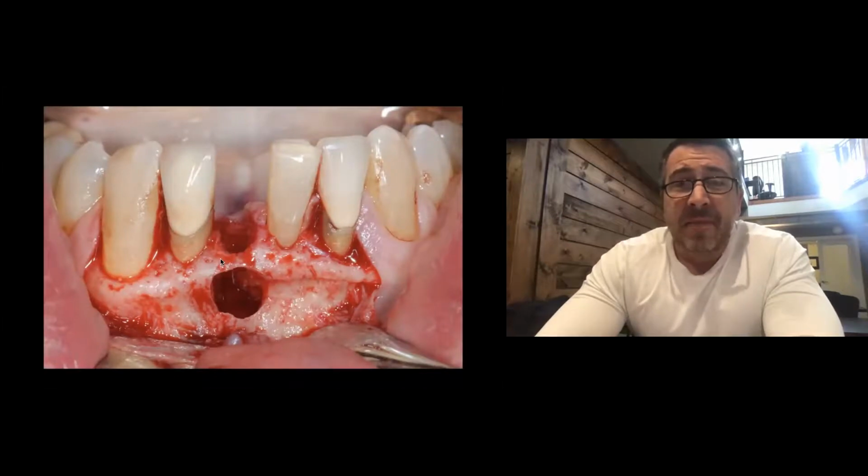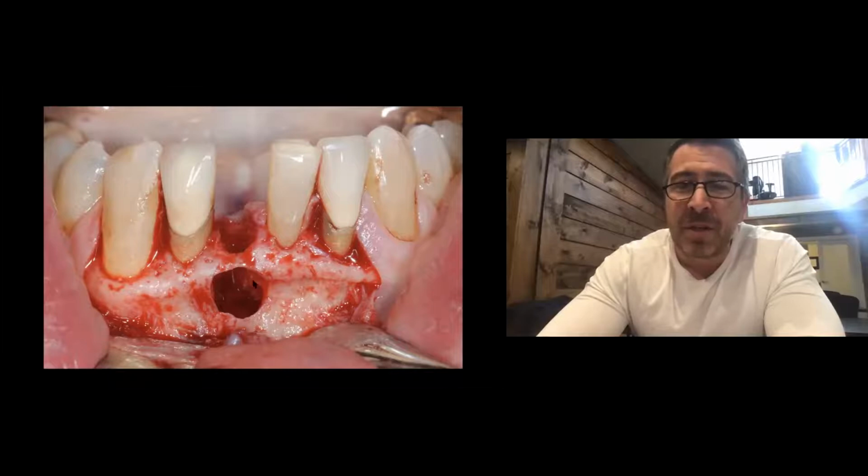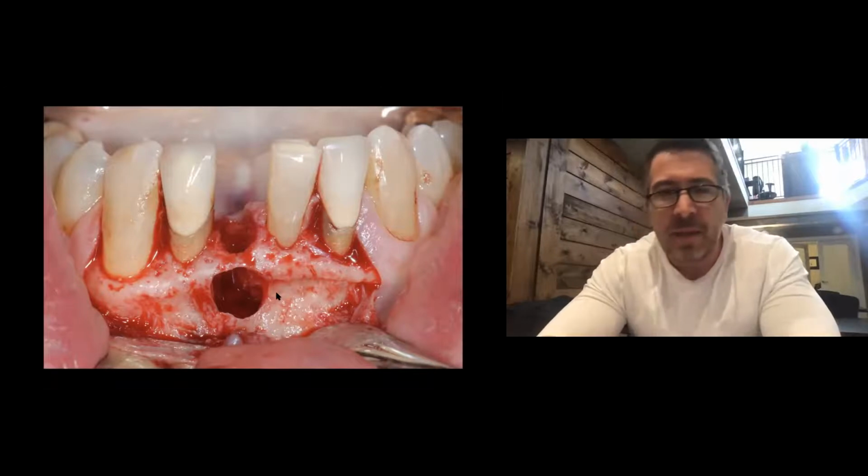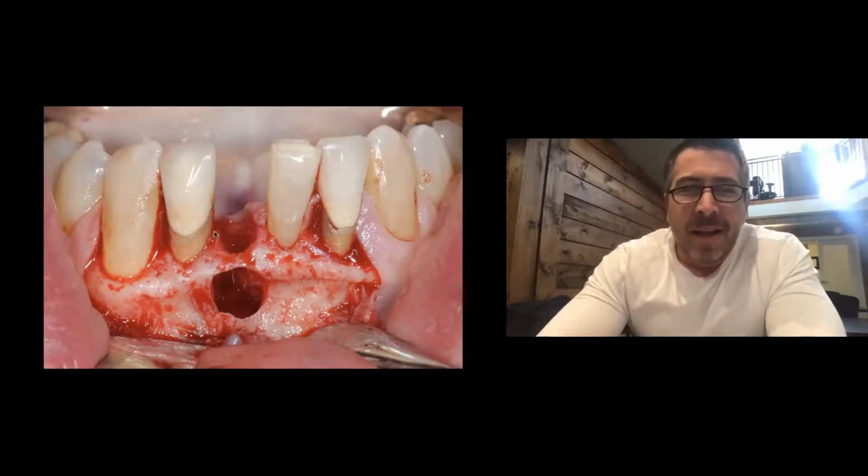Look at this case. If you take this tooth out and you see something like this, what do I care about? I don't care about this big lesion here. This is where this big endo lesion was draining. We curetted it all out. I didn't do as nice of a job as Azim does cleaning the bone, but that's how I do it.